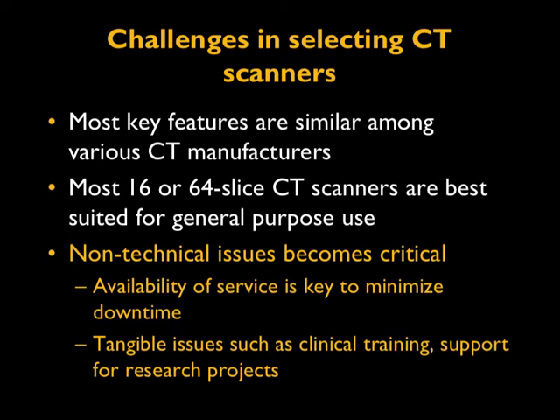for a long time. Especially this is true in developing or underdeveloped countries, where they acquire a CT scanner probably because of some donation from an endowment, and they install the very latest and greatest CT scanner, but forget to look into the availability of service from that particular manufacturer. In such cases, the CT scanners become much less useful, and they spend a lot more time sitting idle because of the lack of service.